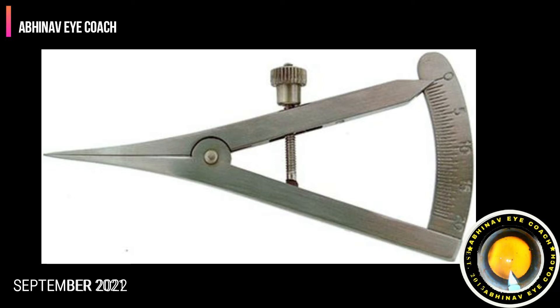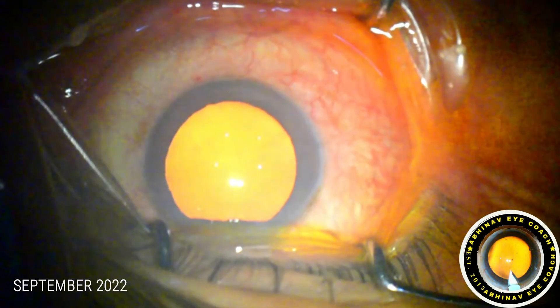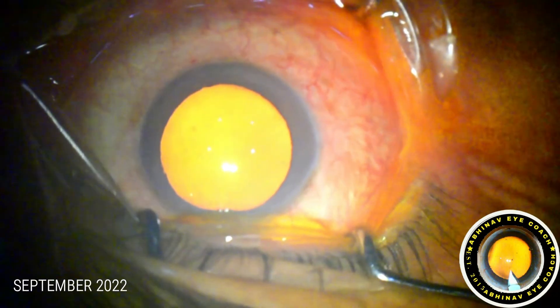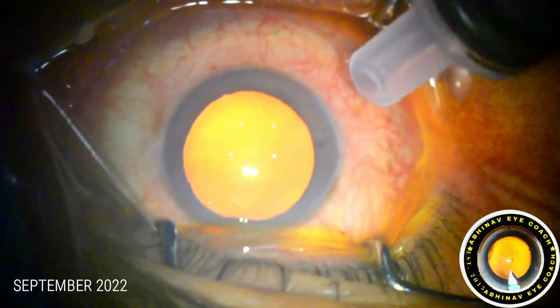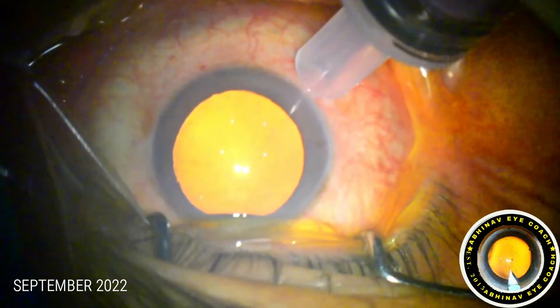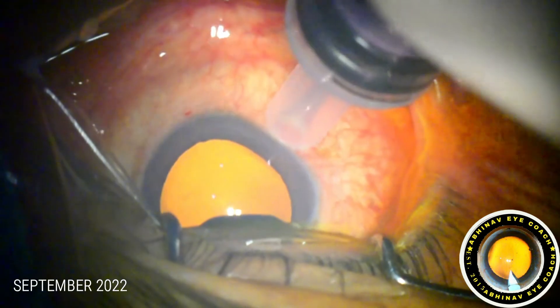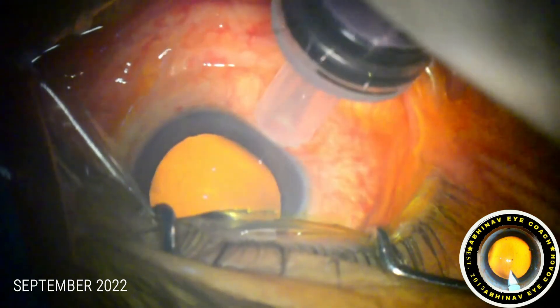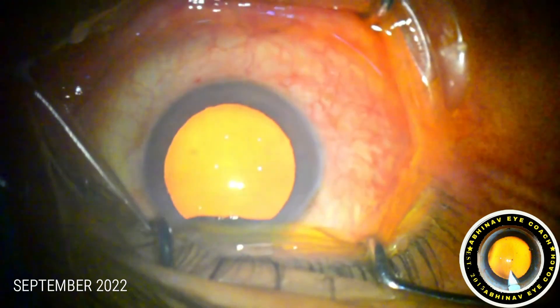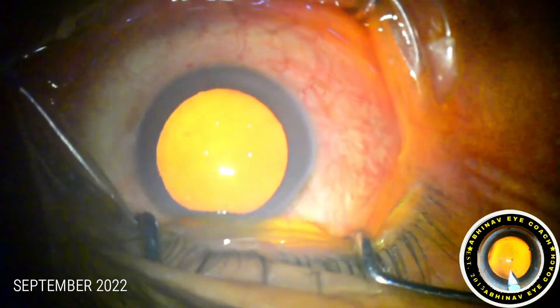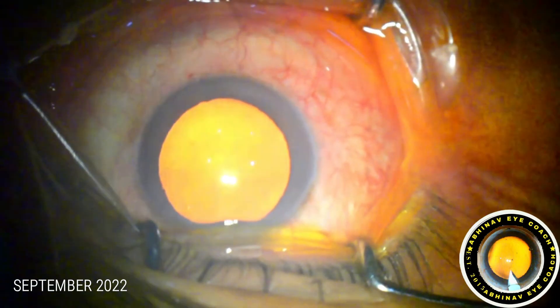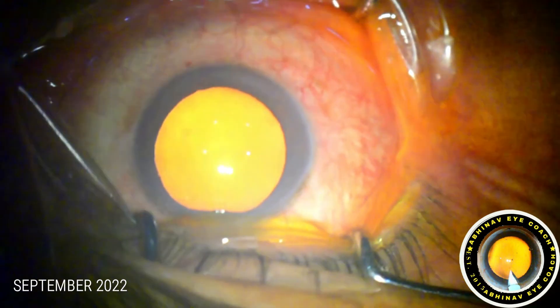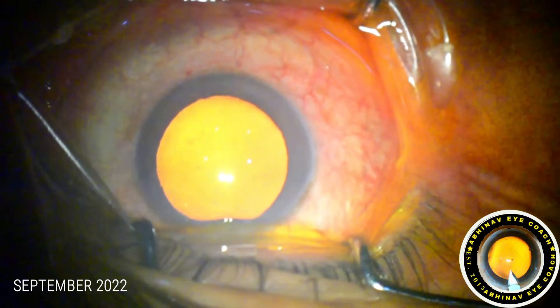We measure this distance from the limbus with the help of Castroviejo calipers. I usually use the hub of a standard 3 ml or 2 ml syringe to measure this distance, which is roughly equal to 3.5 mm. Different markers are also available in the market — you can use those or Castroviejo calipers. We first mark the distance.